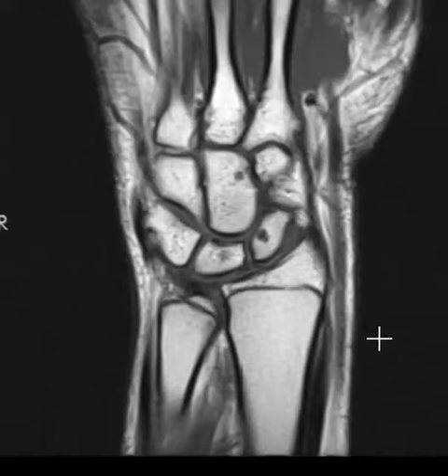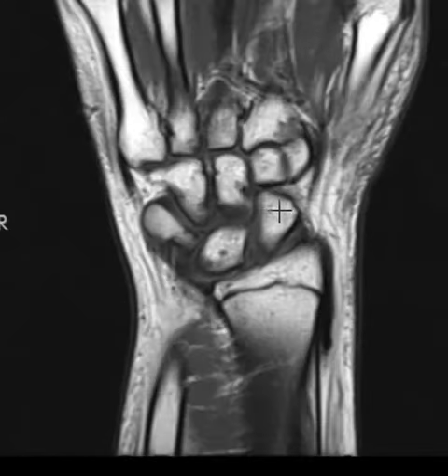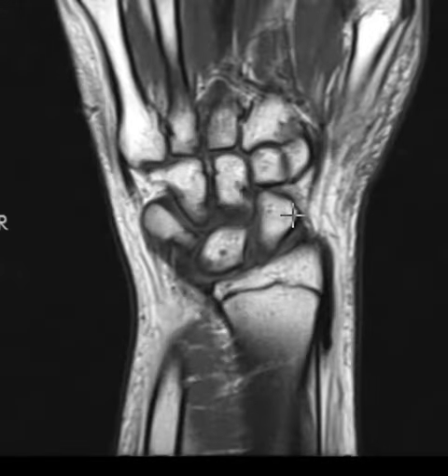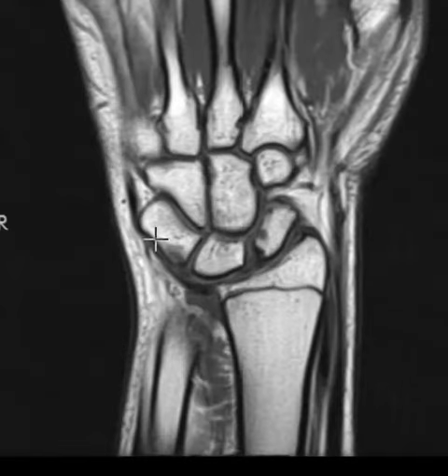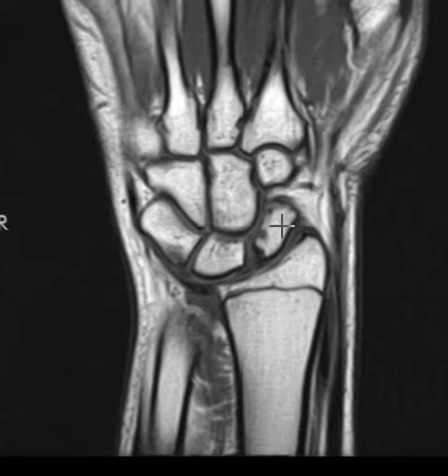Hello, this is Dr. Gay from First Look MRI. This is a 15-year-old female who fell recently, injuring the wrist. They were worried about a scaphoid fracture. This is the scaphoid bone here, and we see that it has a nice, normal, bright signal. These are all the carpal bones, and I do not see a scaphoid fracture, so we answered the question that there's no fracture.